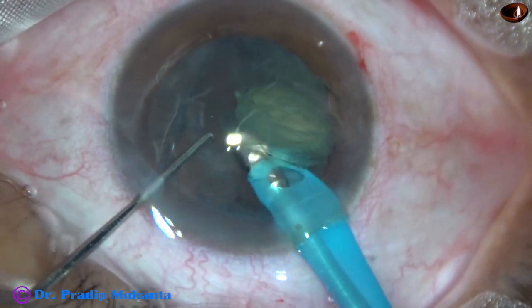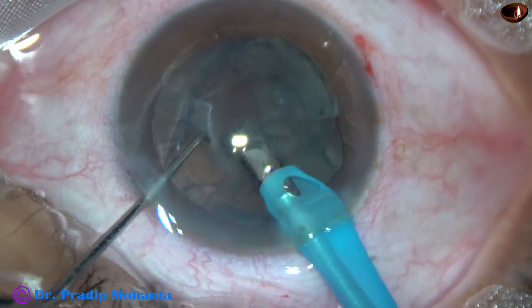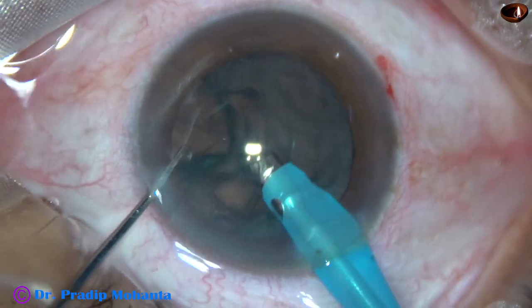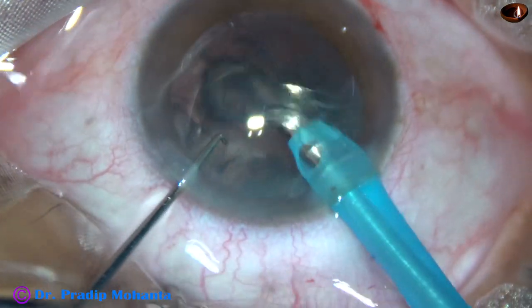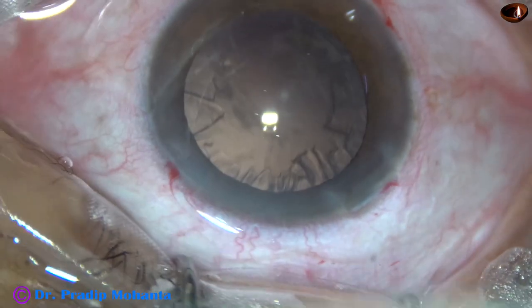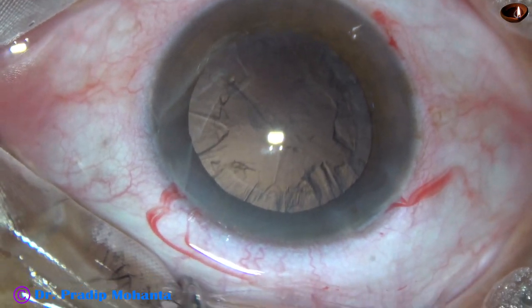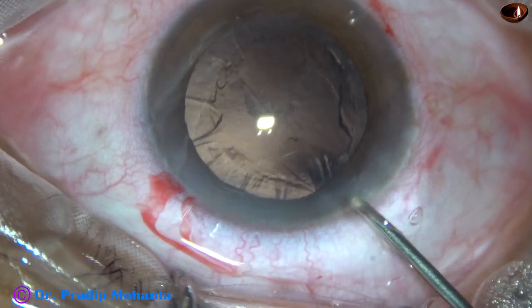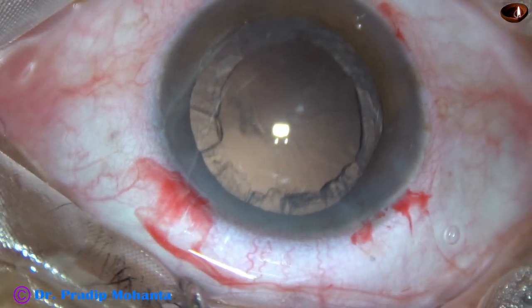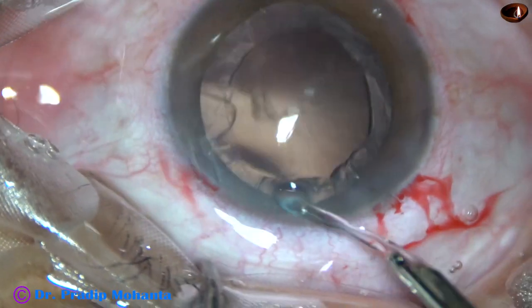With 400 vacuum and 40 flow rate, the nucleus is carouseled. The nucleus is removed and it is done. The carousel technique is very fast, and it actually takes less time for nucleus management than the cortical cleanup.